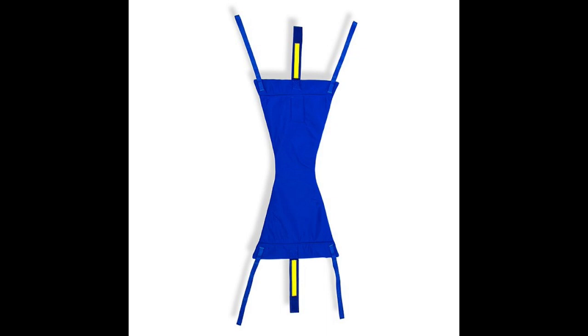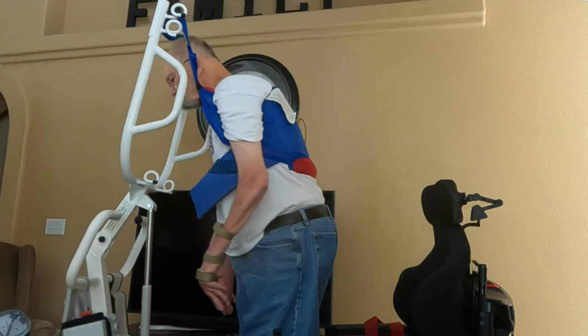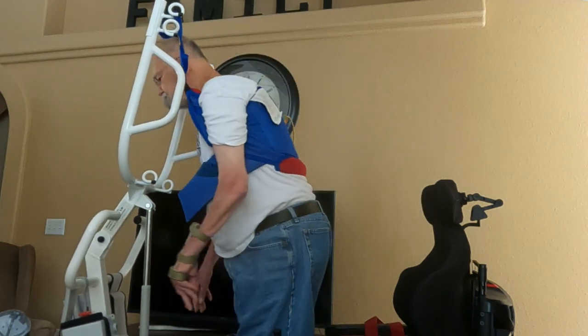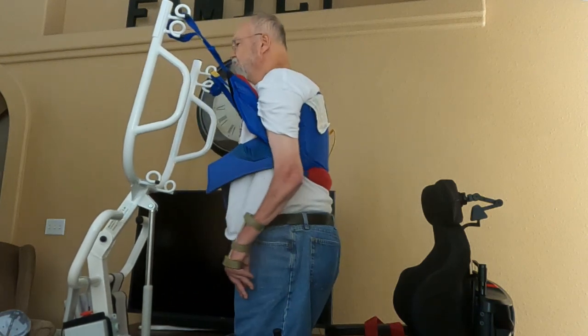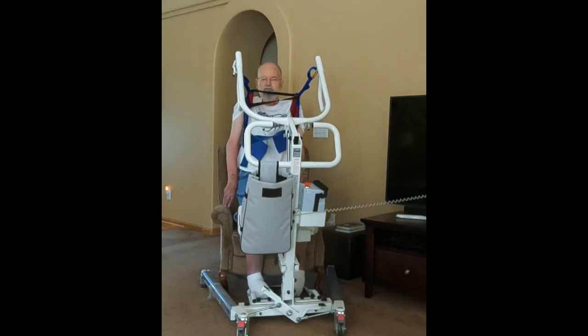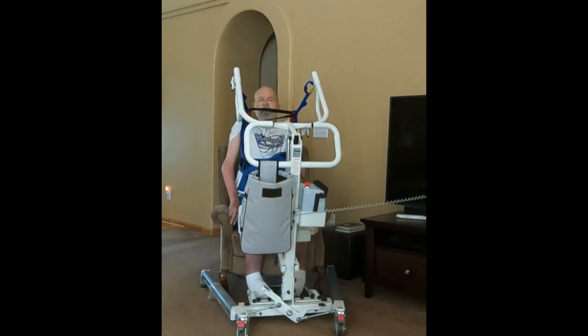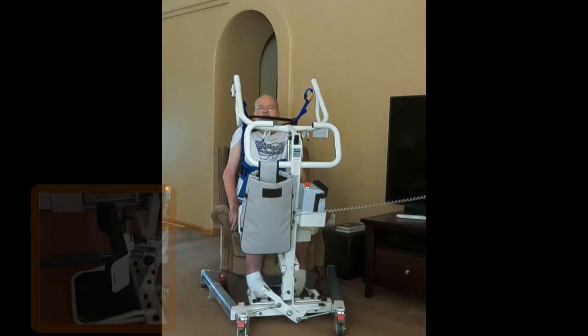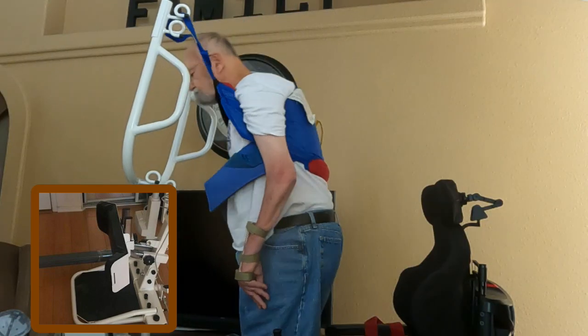Is it true that it would be almost impossible to fall out of a sit-to-stand lift when properly using the recommended sling and lift? Yes, that seems to be true, and although I didn't want to injure myself, I did try various things that could cause a departure from a planned lift, ascent, or descent when using a sit-to-stand lift. I realized that as long as your legs stay captured within the confines of the knee rest, there isn't an easy way to cause a failed lift.